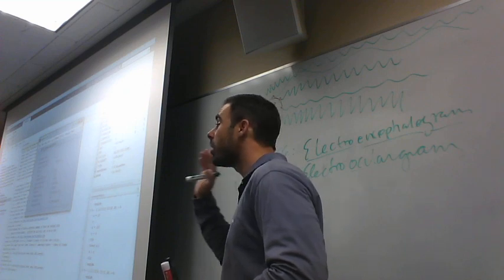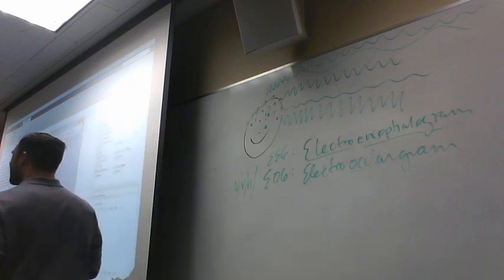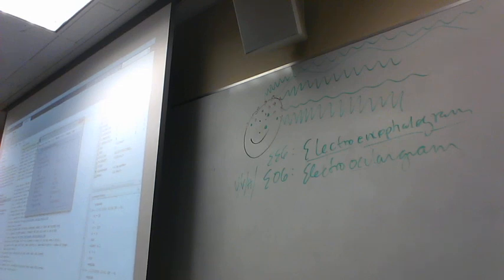Noise. Okay, noise. Like there's a band in the background that's jamming out. What kind of noise? Like a screen. Like a screen? Okay, so a screen's a really good point. We'll get to that actually. I think what you're referring to is noise from the environment that you might use a screen to make a Faraday cage with to filter out. That must have been exactly what she was thinking of.